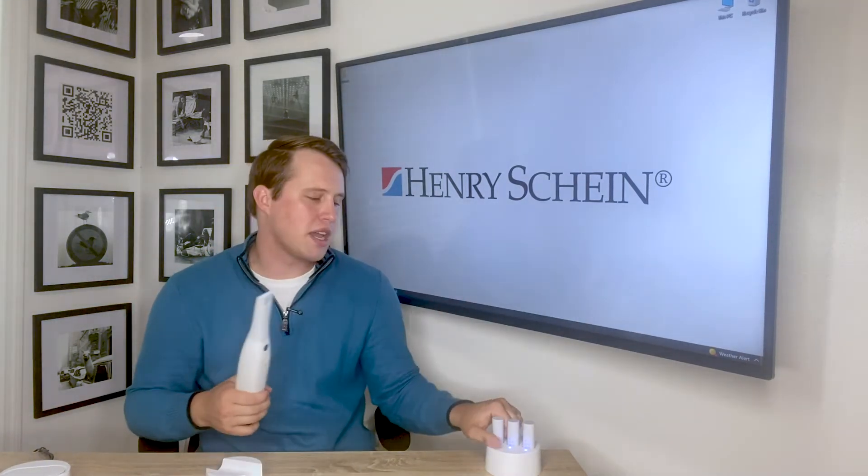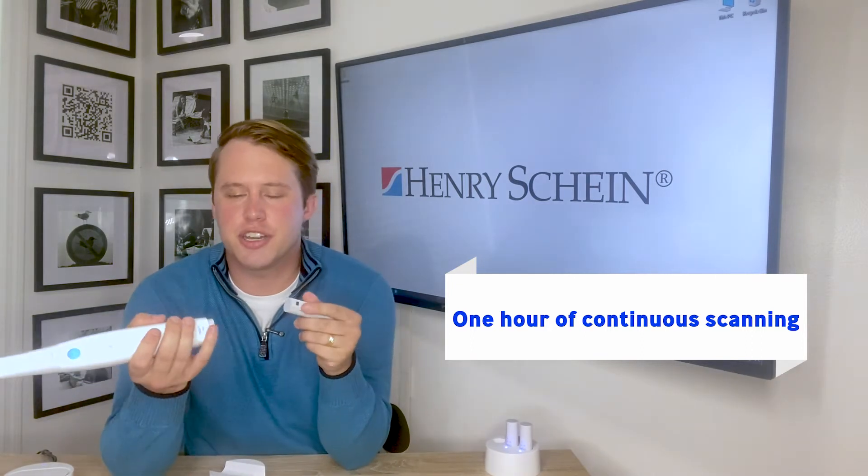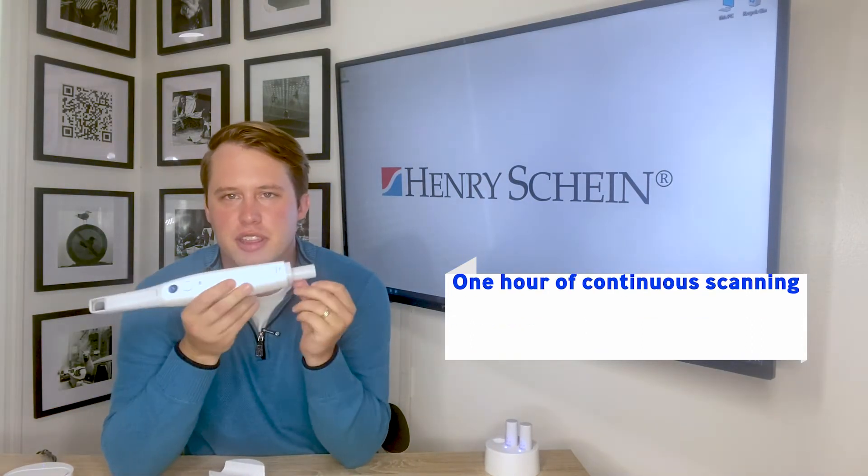It comes with three batteries. Each battery lasts about one hour of consecutive scan time. To power on the unit and connect it wirelessly, plug the battery in the back.